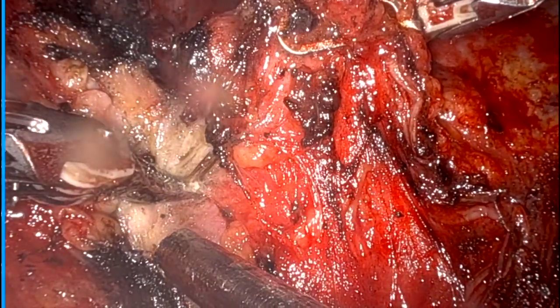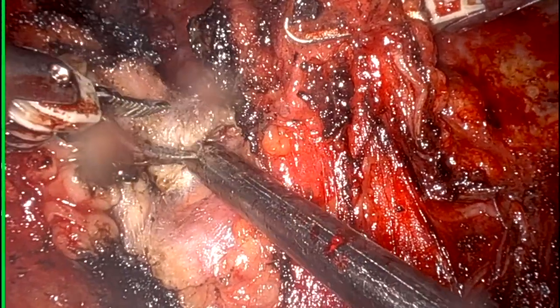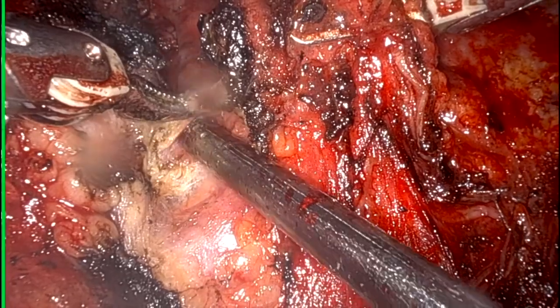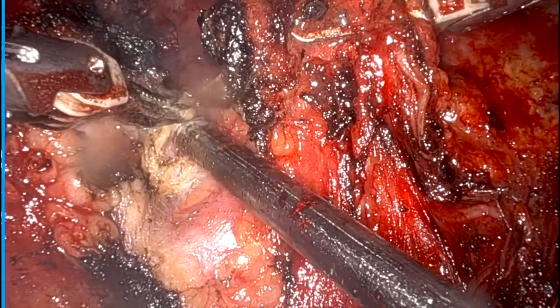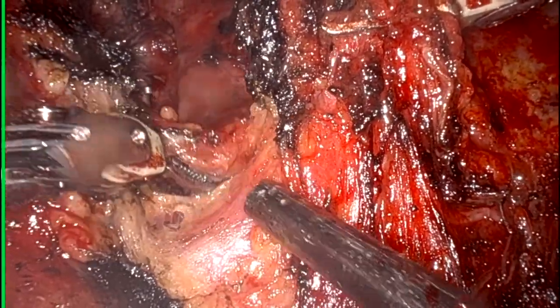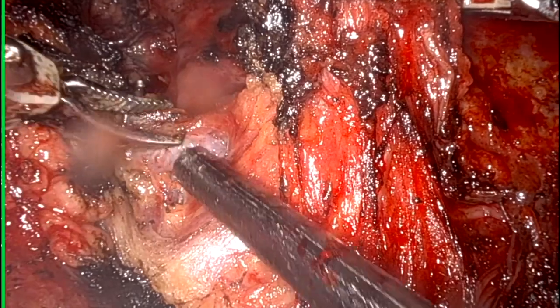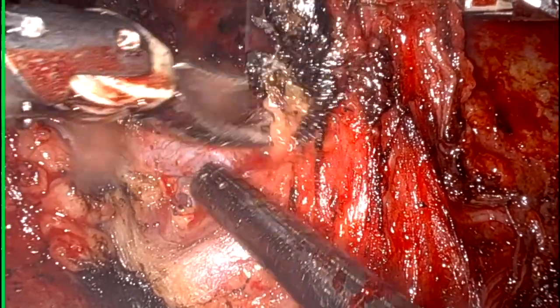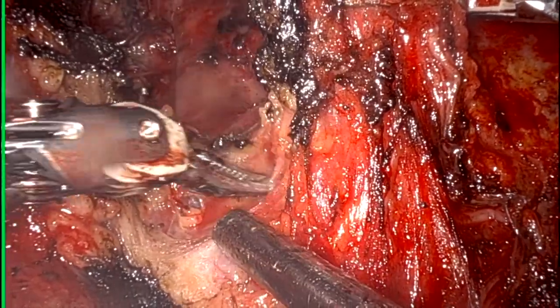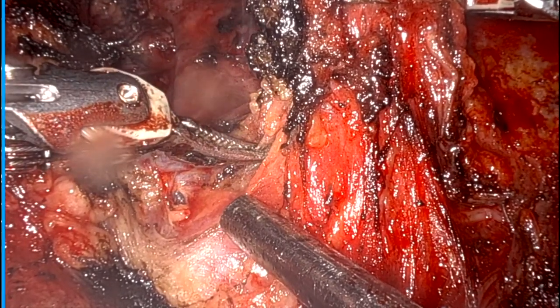My usual practice is to start raising anterior to the external jugular vein. But today, I don't find any external jugular vein till now. So here we got the vein. So this vein is quite anterior. Can you see the very small tributary? First we will bipolarize this and then we will go. So I got this, bipolarized once again, little more and then cut.